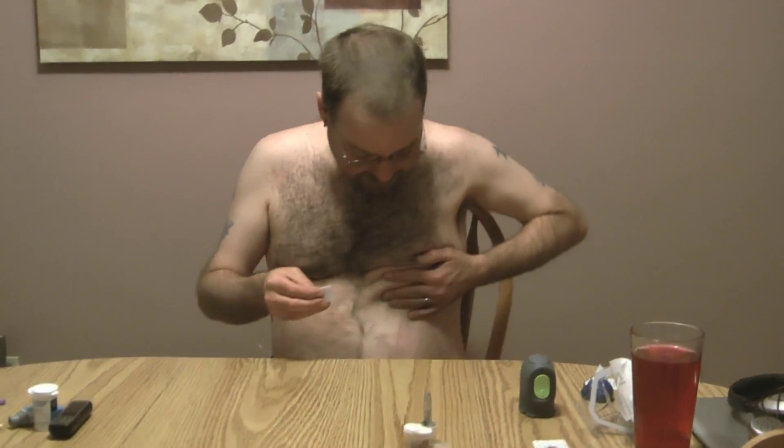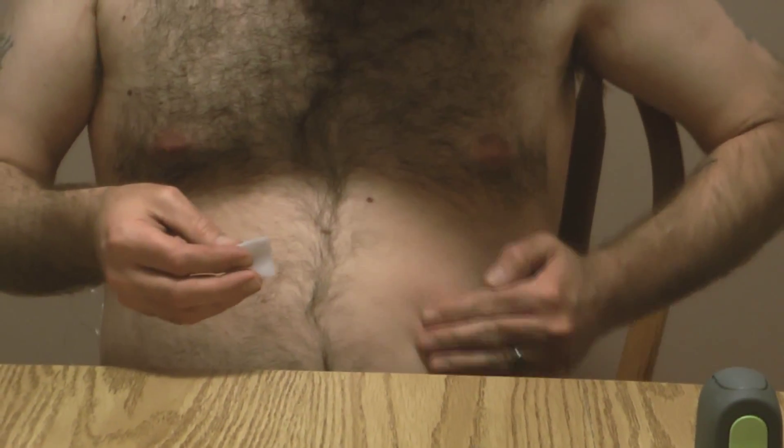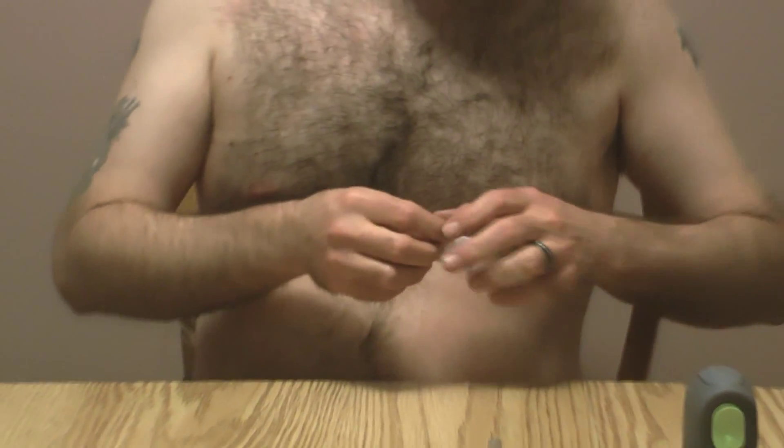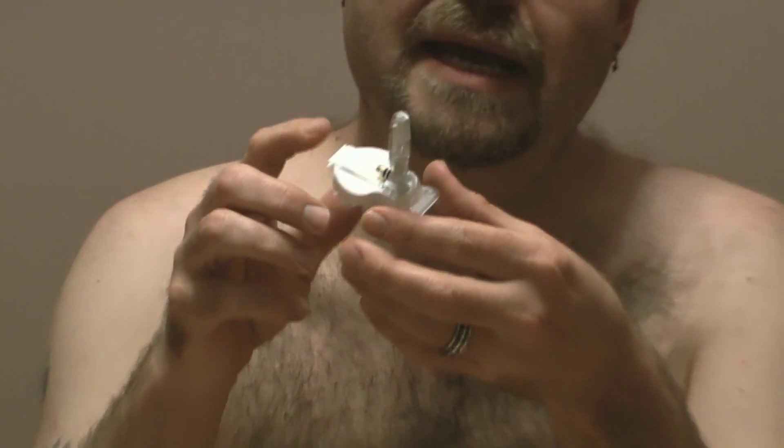Now it's time to insert the sensor. I'll get my trusty alcohol swabs — I've already prepped the other side, I just didn't show it on camera. I'm going to find a spot — right about here would be good. I'm going to clean the area with alcohol; I don't want to put germs inside me. While it's drying, let me show you the sensor. All of the electronics is in this little wafer-thin thing at the bottom. This tall tower here is the insertion needle — it will inject the sensor into me and then the needle itself comes out, so the only thing remaining in me is the sensor.